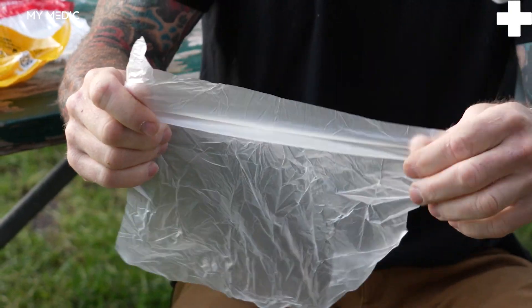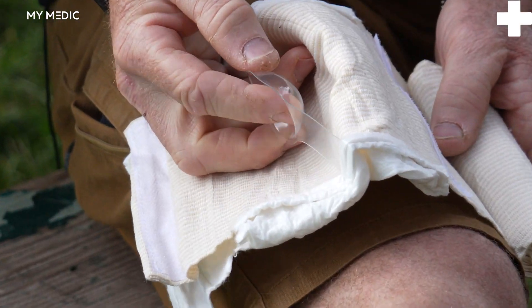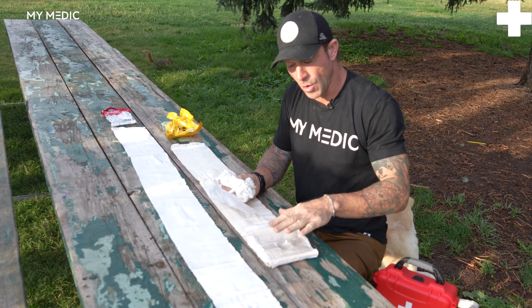With the Mimetic you do get the occlusive sheet of plastic and your gauze. You also get a piece of plastic that can be used as an eye cup, and that puts pinpoint pressure over the top of the wound that you're dressing.